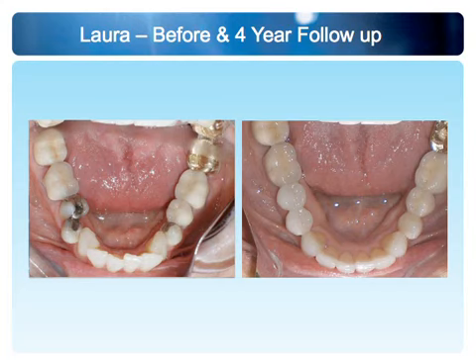So, we are keeping track of those keys to success, right? The secrets. The maxillary arch is the key. The transverse measurement is important. Make sure you look really into what caused the crowding. Is it improper arch form? Improper arch width? Those are the 2 things to keep track of, and buccolingual inclination.